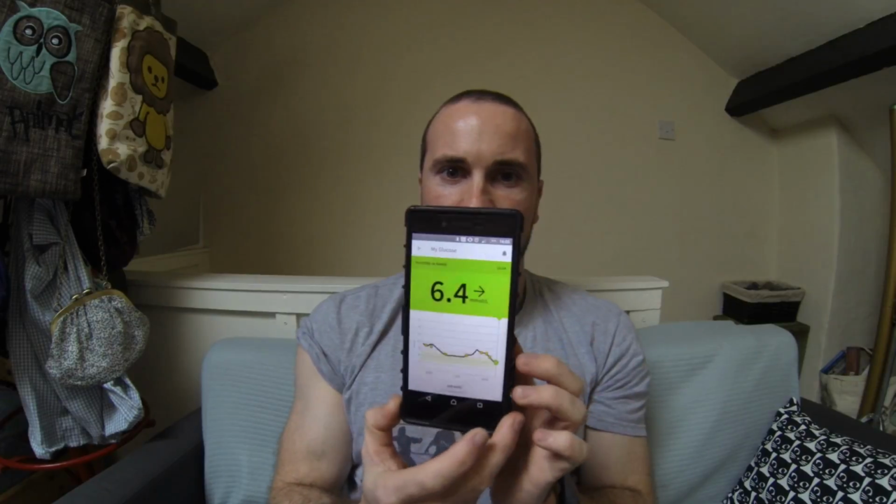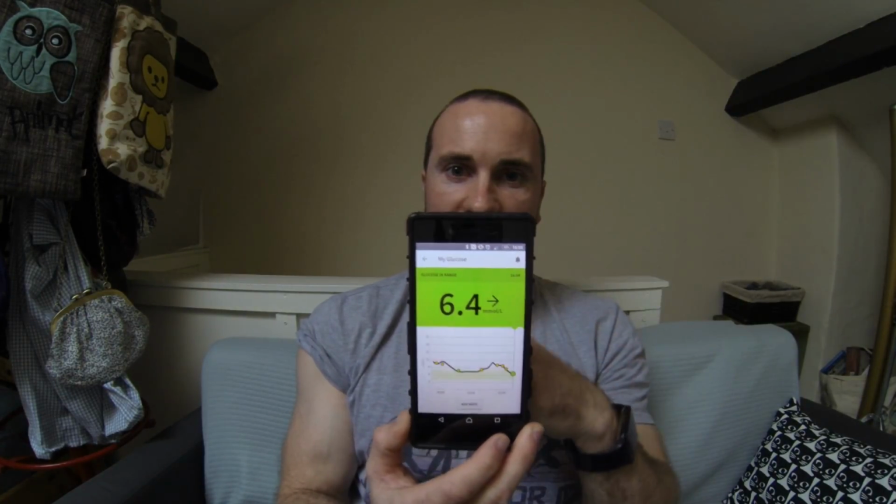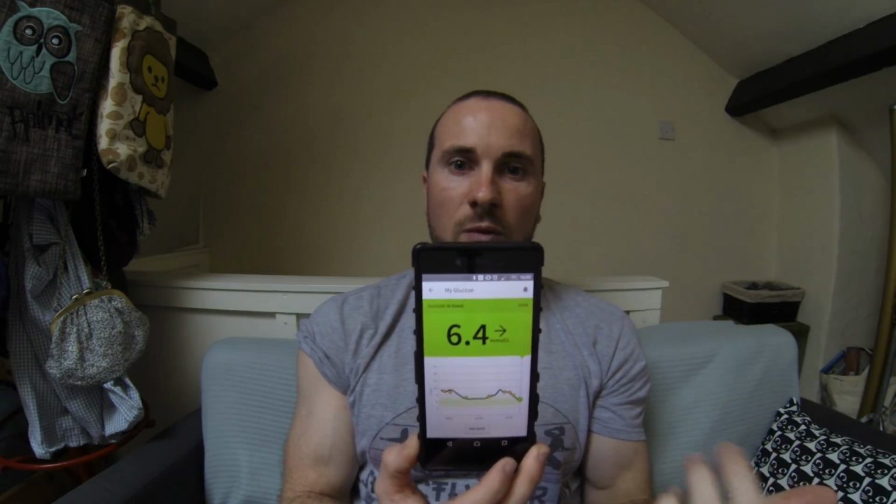And you can see the past few results on here, and you've got the whole graph there, so you can see what it's been doing for the past 8 hours, and the little dots which are color coded, that is the previous results. This next part of the video is just going to be me talking. You'll just hear my voice and I will screen record my phone so you'll be able to see exactly what is going on in the app, and I'll detail and tell you what is happening on each of the screens.